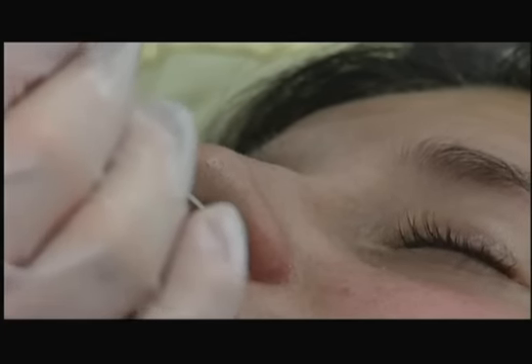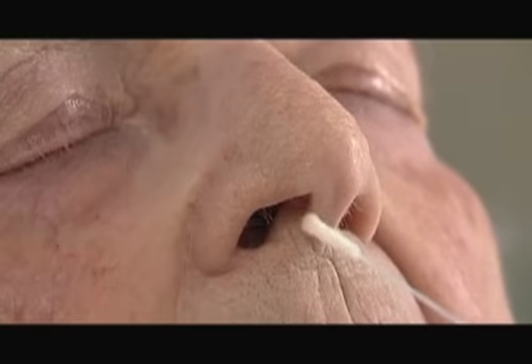However, the depth to which it can be inserted is specific to each patient, and determining this length is shown in each of the accompanying collection clips. Finally, these swabs should only be used for the collection of nasopharyngeal samples from adults and children, and should not be used to collect samples from any other of these sites.